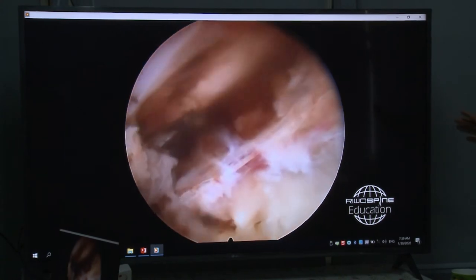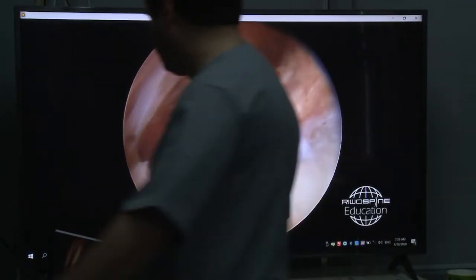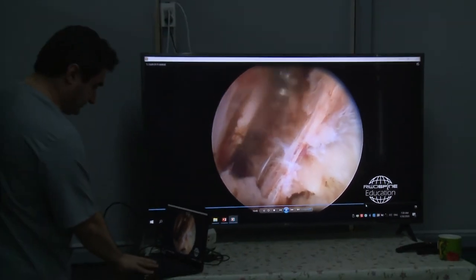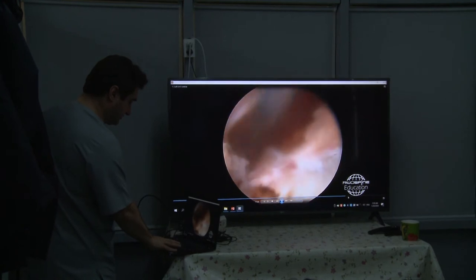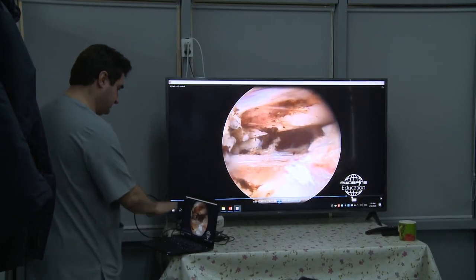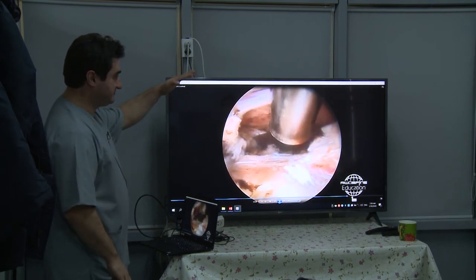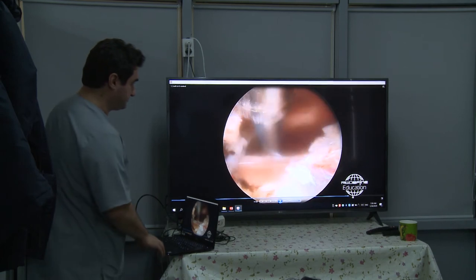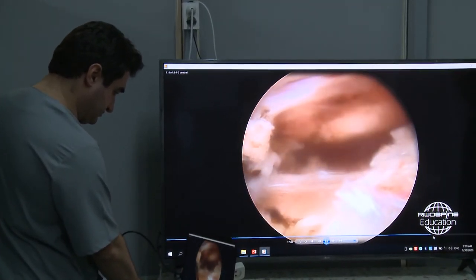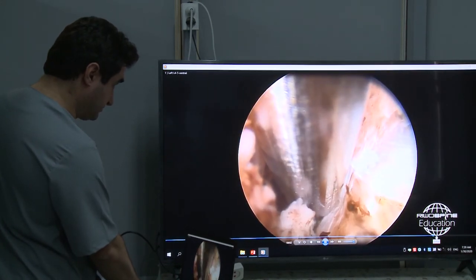Almost done, yeah. This is it. If you see this fracture, it's okay. Then, of course, at the end, if you want to see the exiting level, proceed a little bit. So the decompression is done. You see this. The only thing I try now is to go into the defect to the disc, so I go into the disc now.